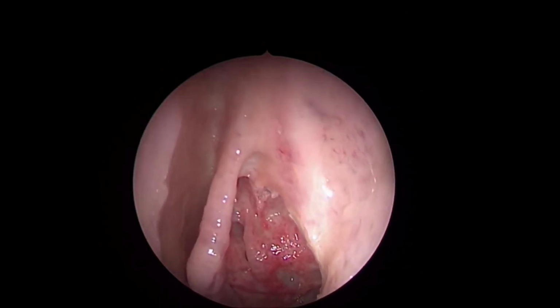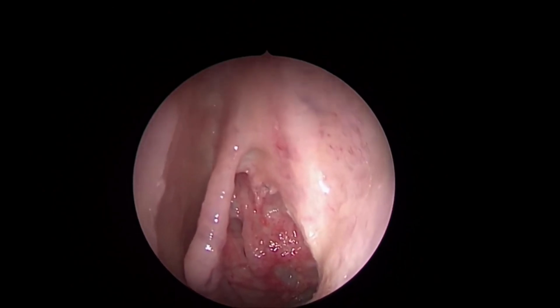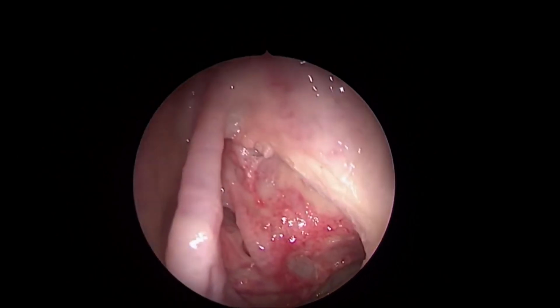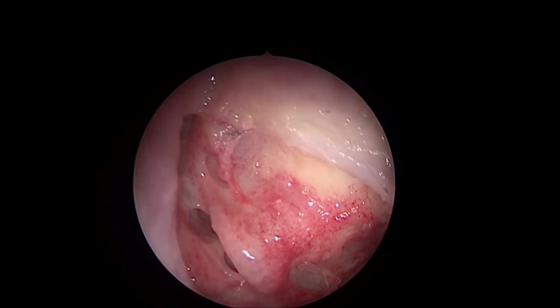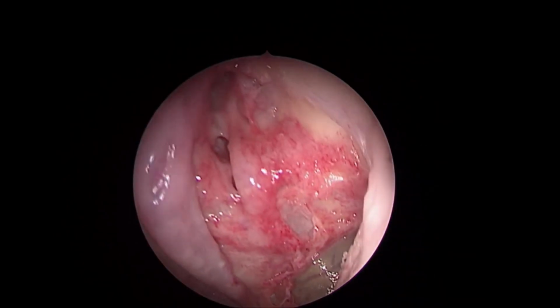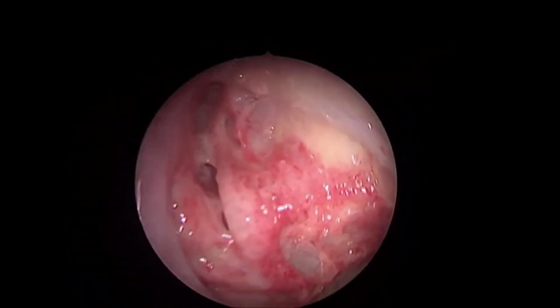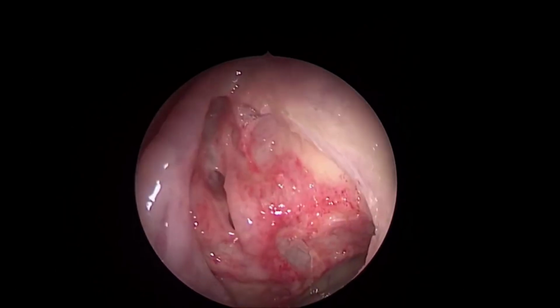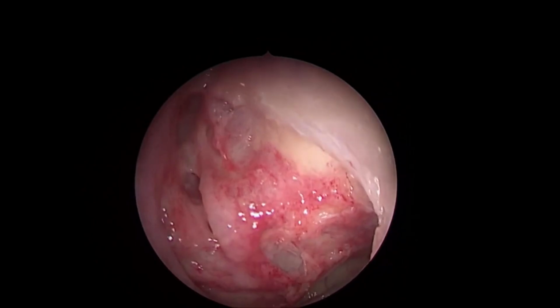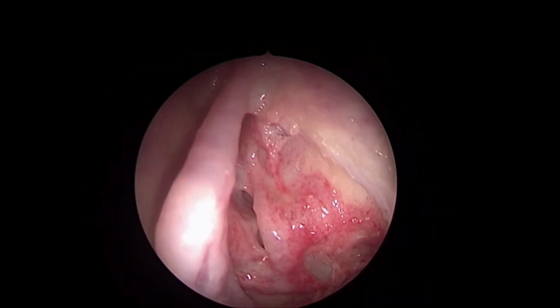Frontal sinus is so close to skull base, we are always scared of giving a CSF leak. We are always scared of injuring the orbit as it is in close vicinity, and injuring the anterior ethmoidal artery sometimes. All these fears make the surgeon frightened. If you use a 70 degree, believe me, I'll tell you the landmark, you can easily access the frontal sinus without any problem. The only thing is visualization, landmarks.